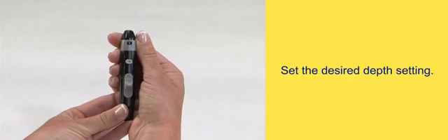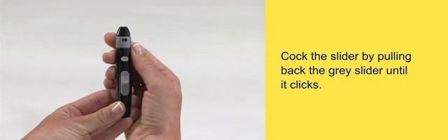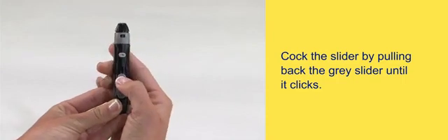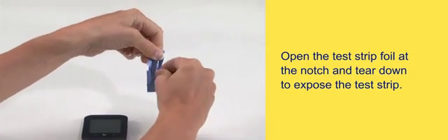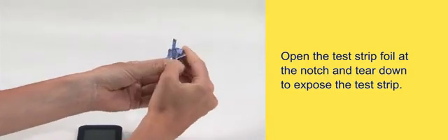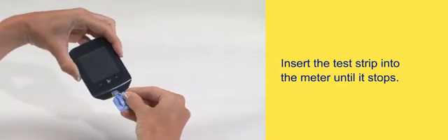Set the desired depth setting. Cock the slider by pulling back the gray slider until it clicks. Open the test strip foil at the notch and tear down to expose the test strip.